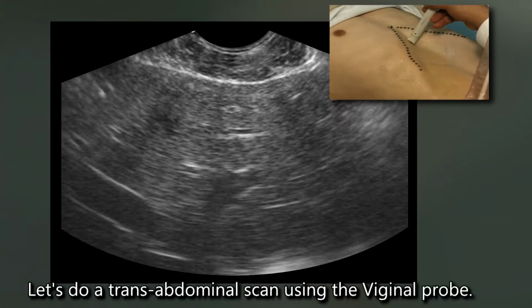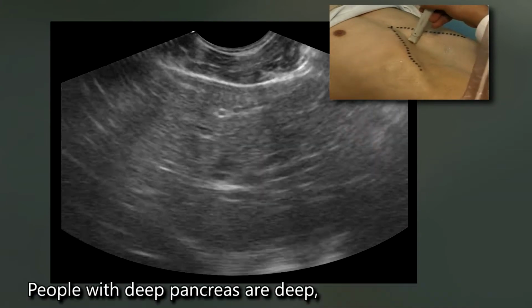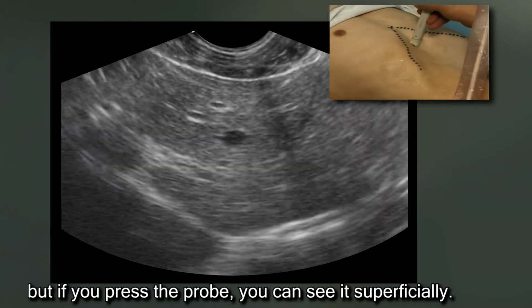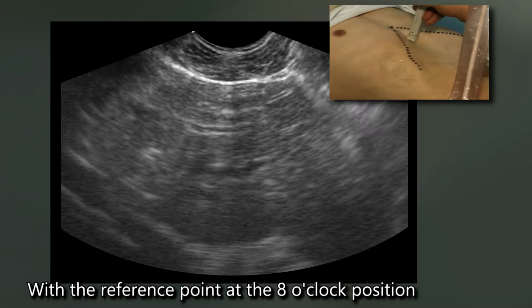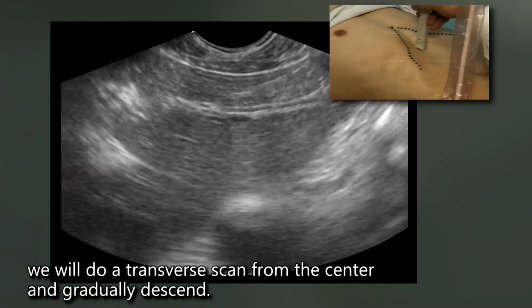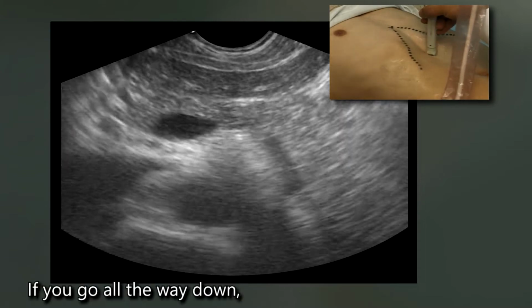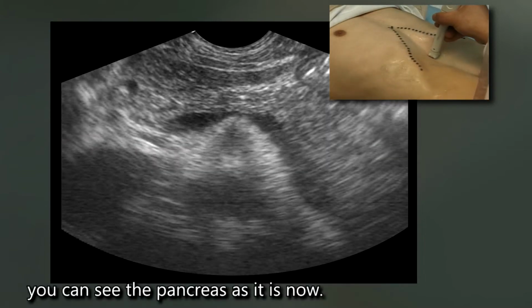Let's do a trans-abdominal scan using the probe. People with a deep pancreas, if you press the probe, you can see it superficially. With the reference point at the 8 o'clock position, we will do a transverse scan from the center and gradually descend. If you go all the way down, you will see the pancreas as it is now.